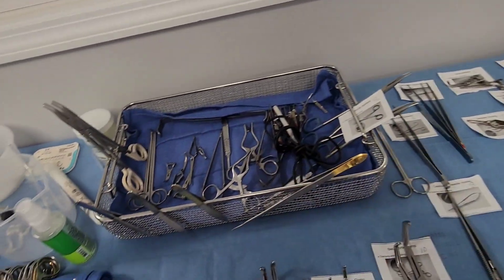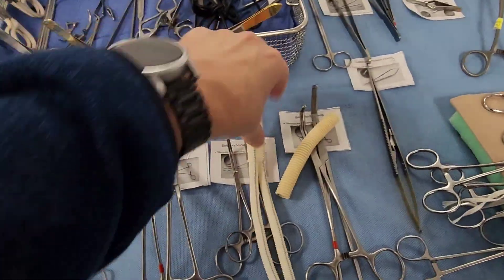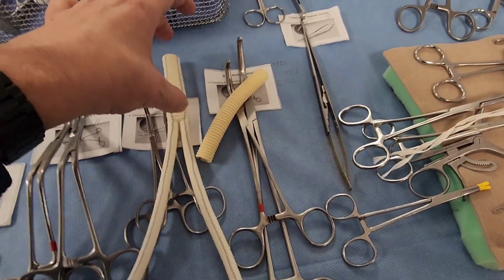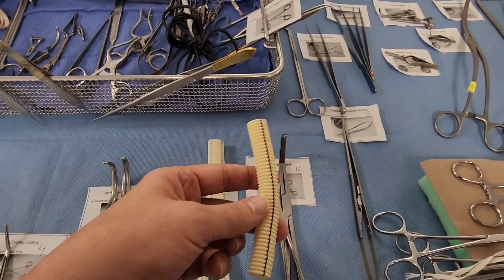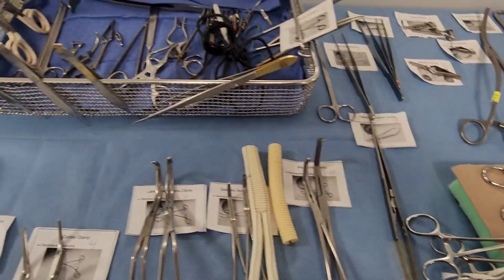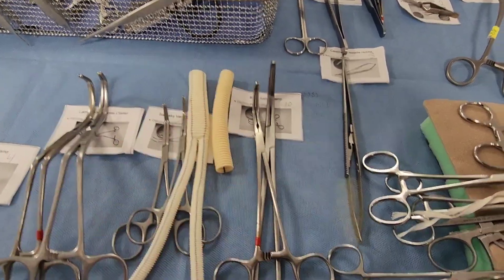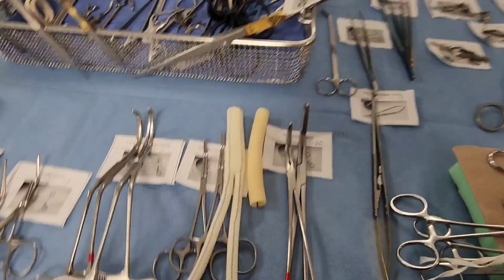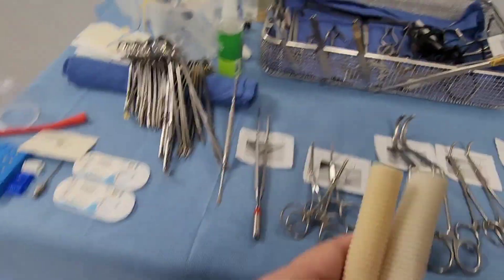Over here are some bifurcation grafts and straight grafts. The bifurcation graft is Y-shaped and typically goes from the descending aorta into the iliac and femoral arteries. Straight grafts are used in cases like open aortic aneurysm repair. These grafts are used in open technique procedures — a bit more complex than peripheral vascular, moving into open aortic or more extensive surgery.